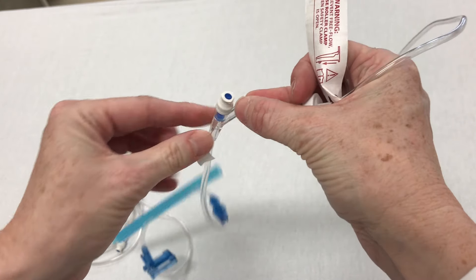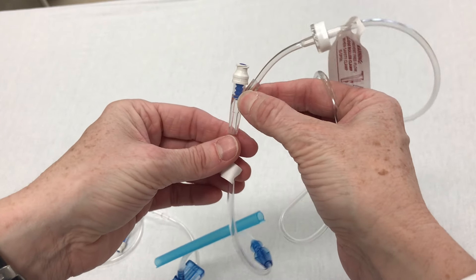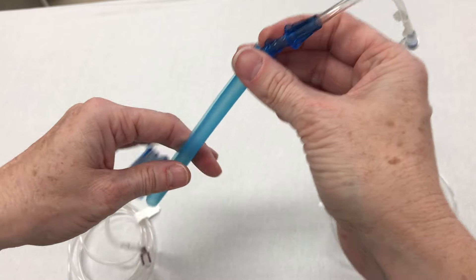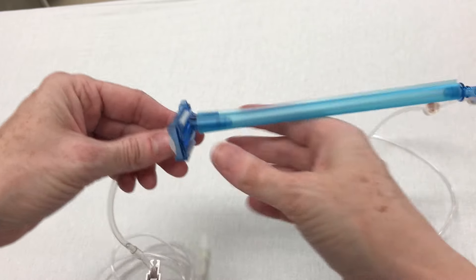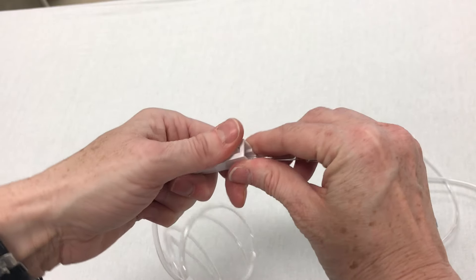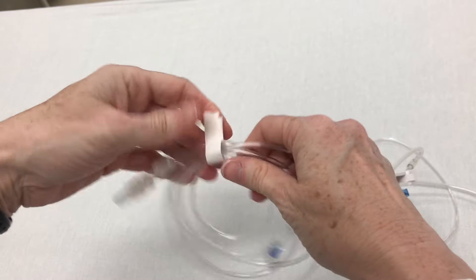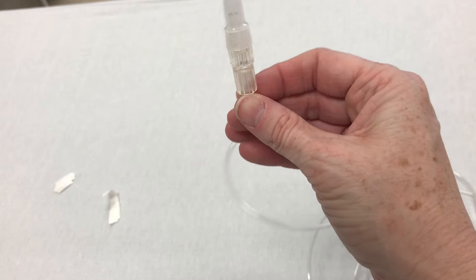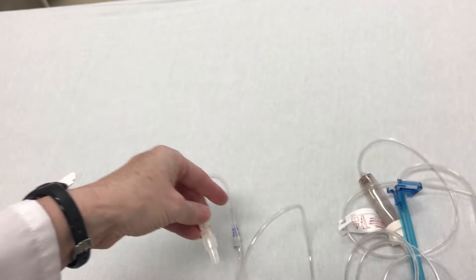Then we come to our first smart site — this would be where we could attach a secondary line. As we continue down the line, we come to the blue sheath that covers the pump segment. This is the portion that will go into the Alaris pump, and for now we'll keep the blue sheath on. The next thing we come to will be the roller clamp. We'll use this to manipulate the flow if we are running fluid by gravity, and also to clamp off the line before we spike our bag. Finally, as we continue to inspect the line, we'll come past another smart site down to the male luer, which is also a sterile tip ready to be attached to our patient.